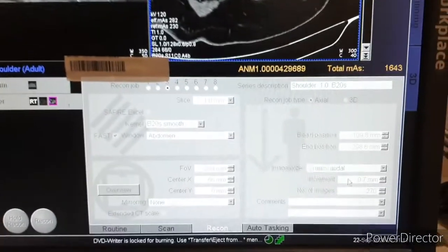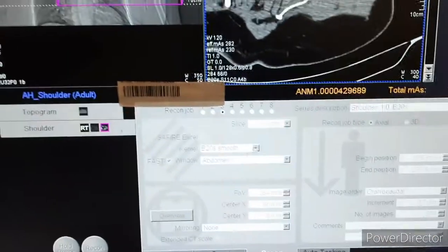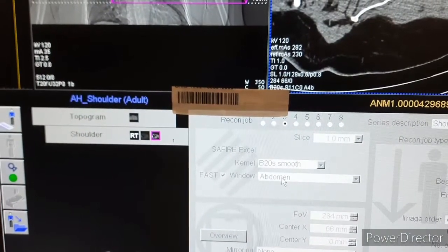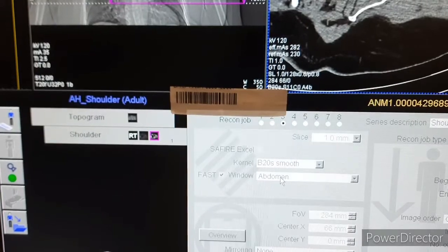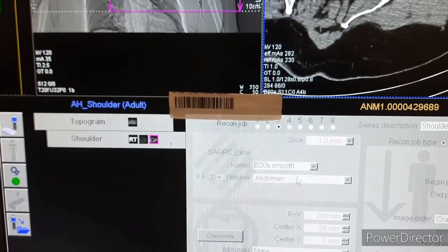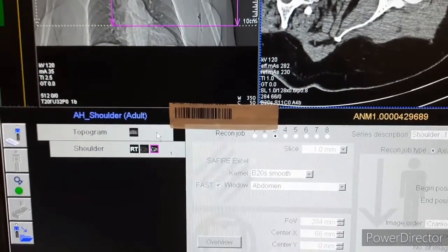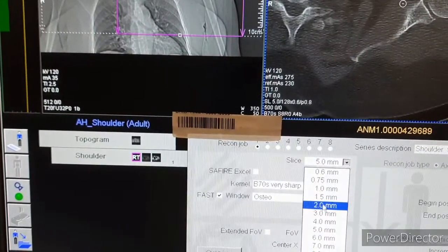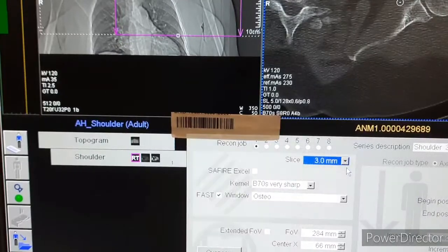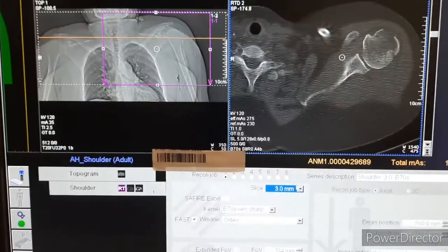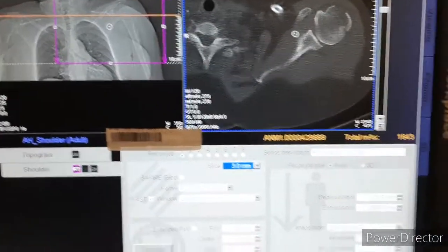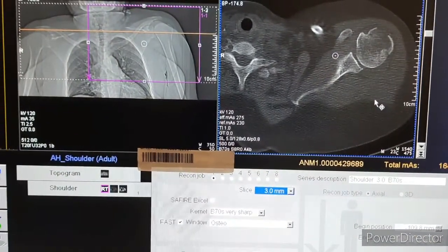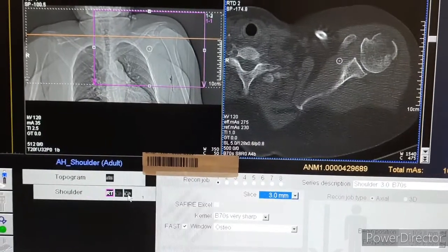For soft tissue reconstruction, change your filter to B20. You can use the abdomen filter. For filming, you can change as per your filming format — you can keep it at 3 millimeter slice thickness with a gap of 3 millimeters.